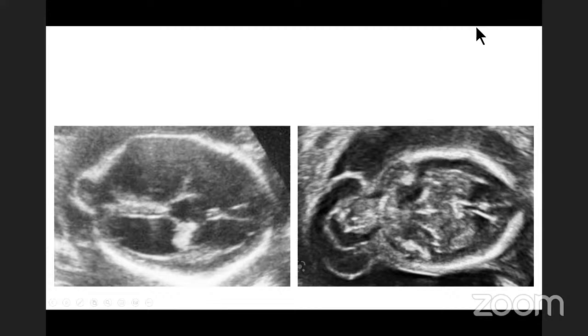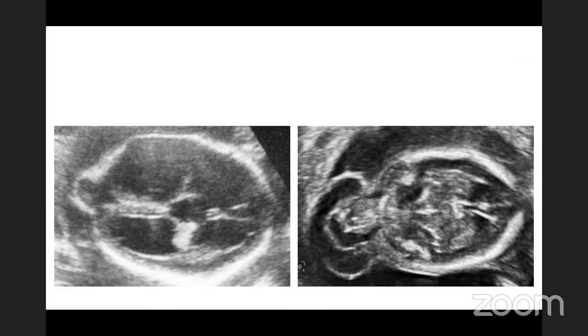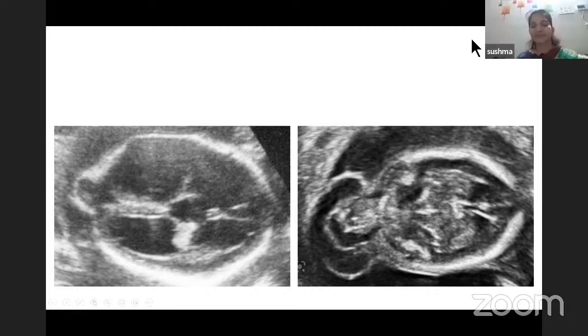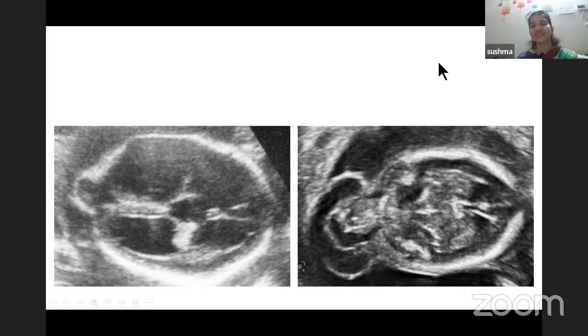Meningomyelocele. Okay. Arachnoid and Blake's pouch cyst. Okay. And encephalocele. Ventriculomegaly. And another doctor, Jeevan Jyoti, also responded encephalocele only. So encephalocele is the right answer, but we also have in this image ventriculomegaly here.